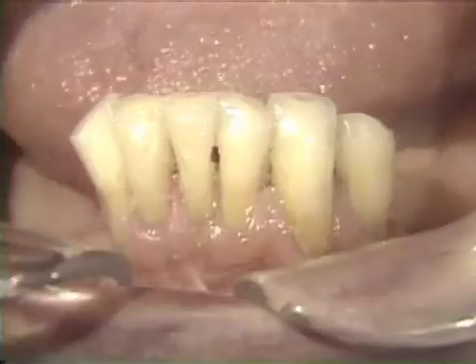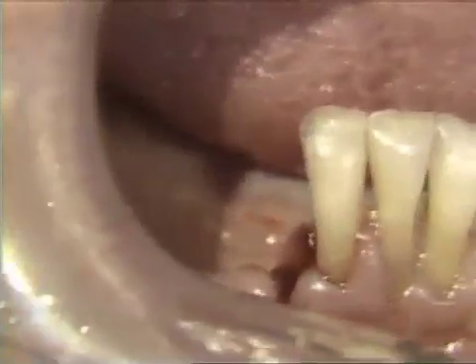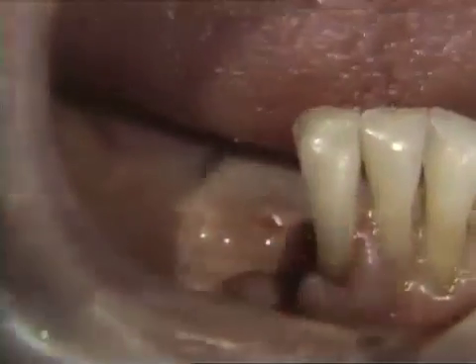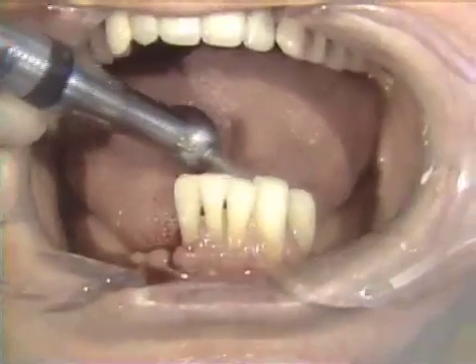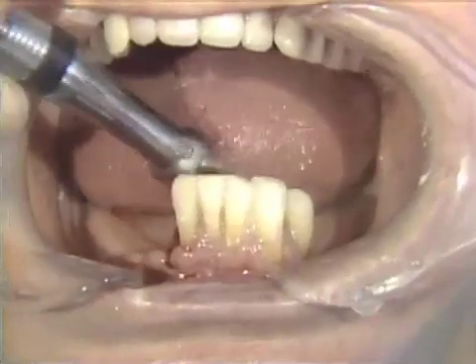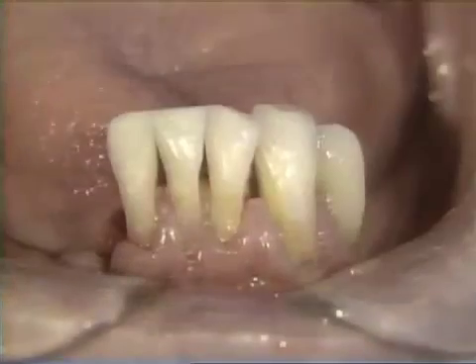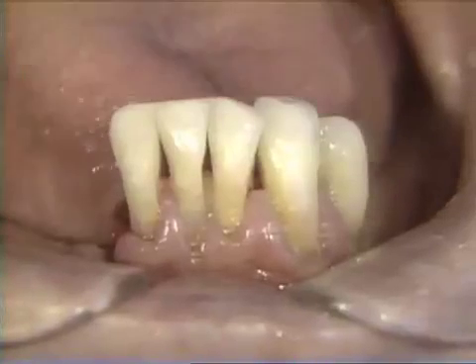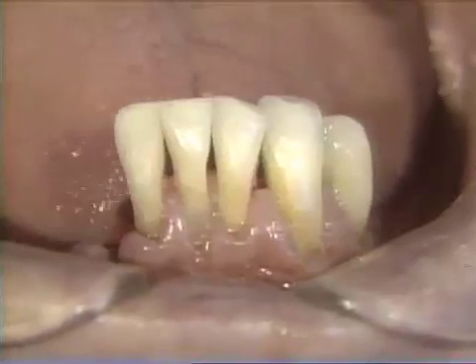On a subsequent visit, you can see the good tissue reaction. After extraction of tooth number 26, tooth number 25 is reduced at the very distal at the incisal as seen from the pencil outline. The irregular incisal edges are reduced with a diamond and discs at the patient's request for her comfort. After all additions and modifications are made, alginate impressions are taken to be sure the desired result has been achieved. A custom tray will be made from this model for the master cast impression.